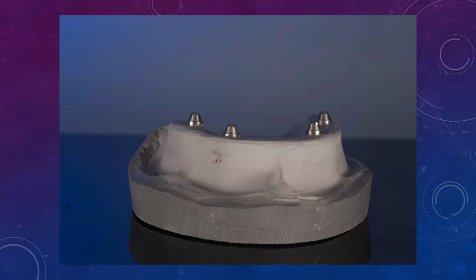And from here, what I would do is make an impression jig, not a verification jig, but an impression jig. I have a lot of doctors, especially prosthodontists, who will put impression copings, like open tray ones, not closed tray ones like we did, and tie everything together with some floss or some orthodontic chain, and put a bunch of composite there to hold things in place, and they'll take a final impression. For residents, it's a little bit too complex, so I make it a little bit simplified.